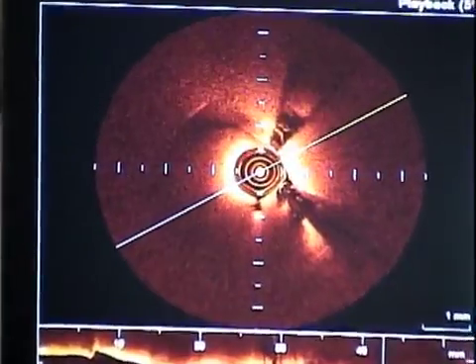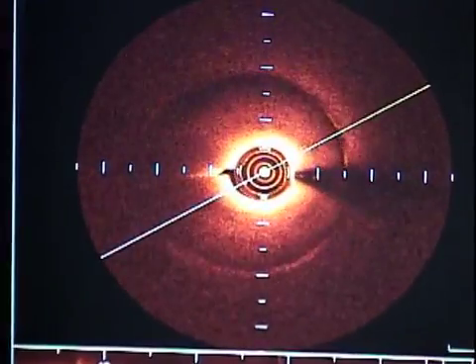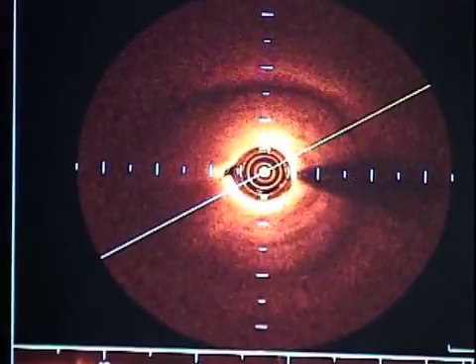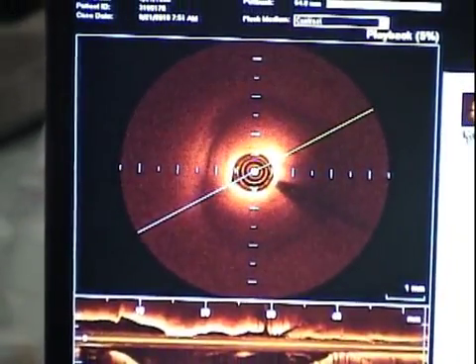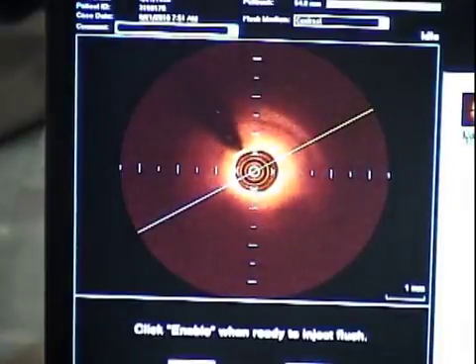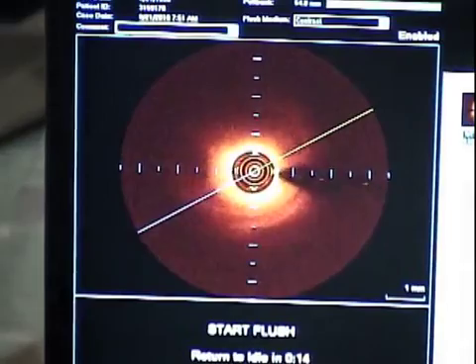Samin, are you happy with the stent expansion there, and I think it would be very useful to see IVUS also after this. Yes. Okay, we can do that. We'll do one more run of this and IVUS, and I think we'll do basically the circumflex intervention offline. Okay, how are we? Ready?